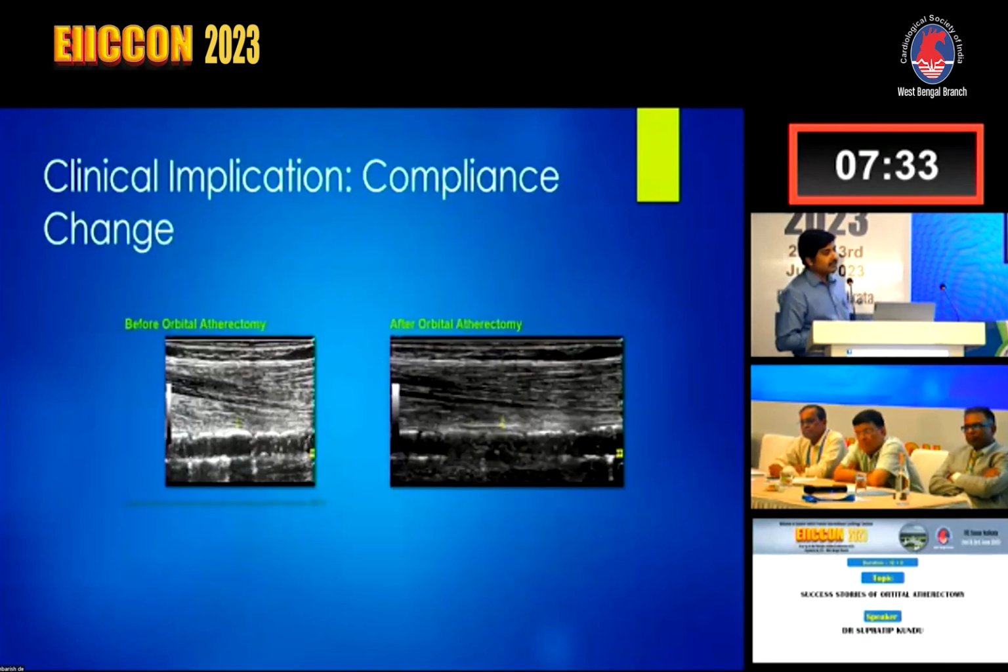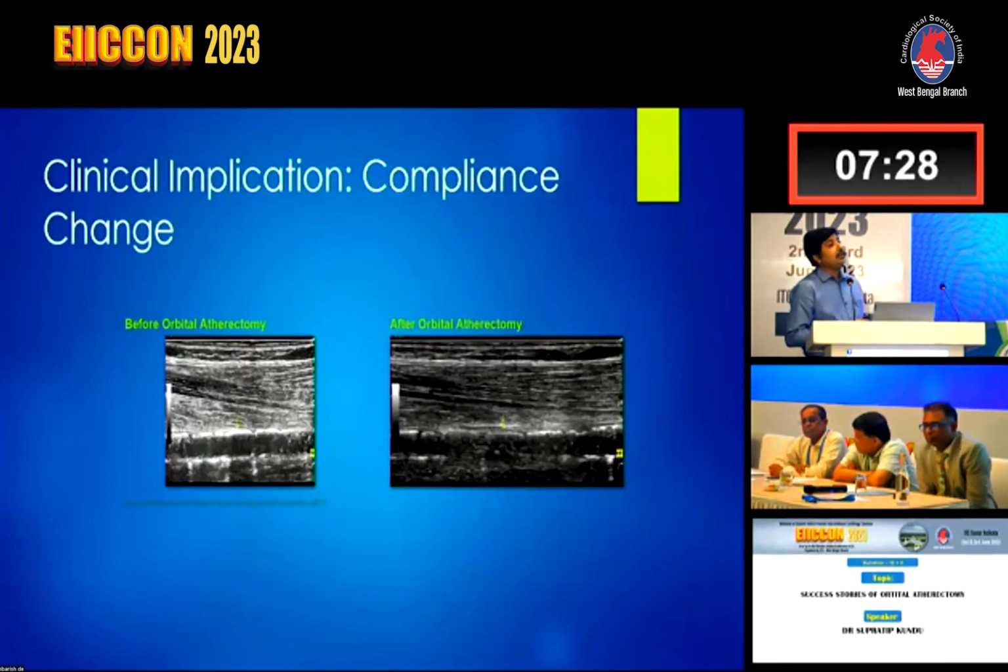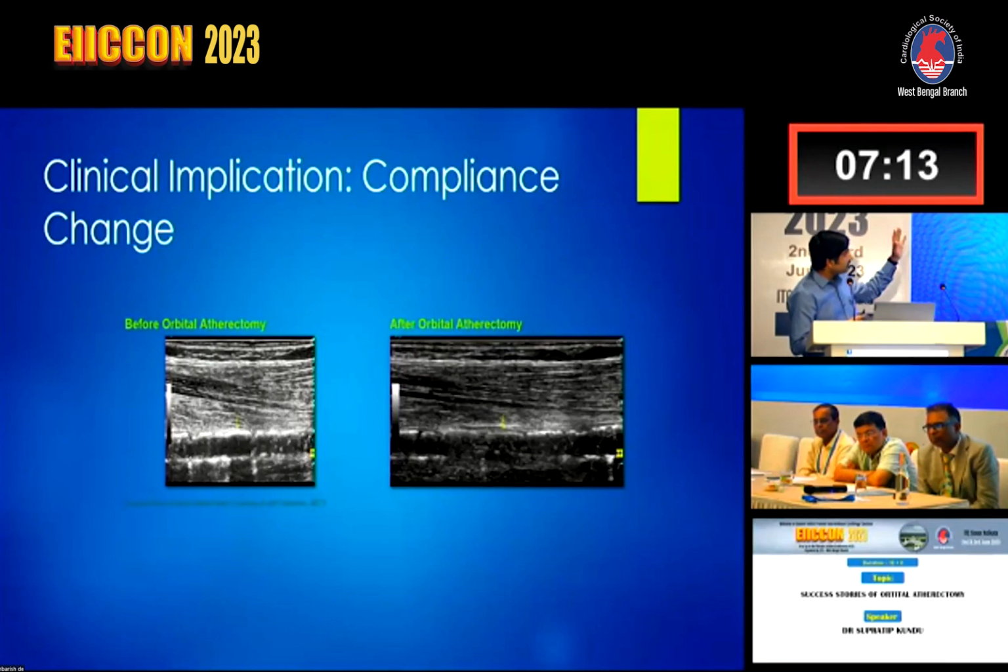another mechanism of action. It also acts on the medial calcium, because when the crown rotates and the drive shaft also rotates in an orbit, it creates pulsatile forces which affect the medial calcium and fracture the medial calcium also.